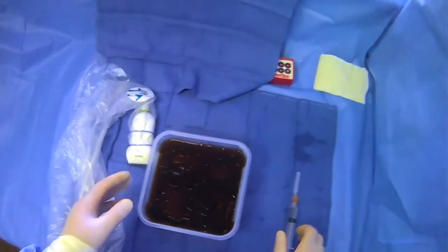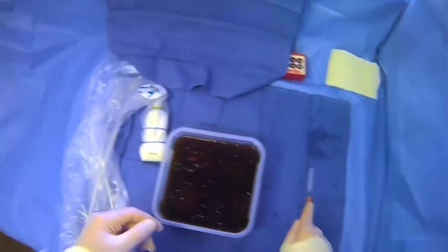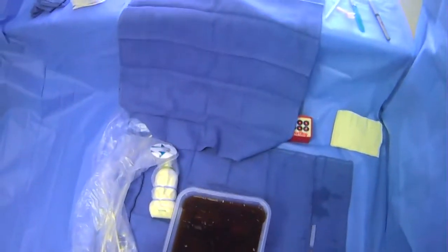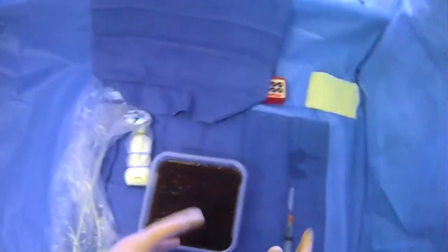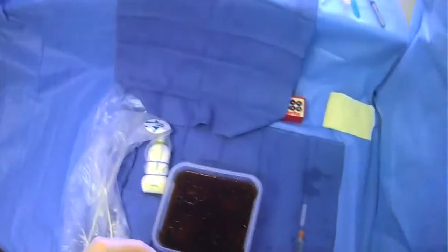For this purpose, I have a 25-gauge 3-centimeter needle, and I know that my distance is going to be in the 2-3 centimeter range before I'm actually able to draw back fluid. So I know that it's safe to hub this needle in the area that I've marked and scanned, and that should get me into my ascites.